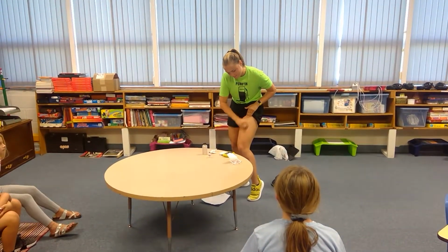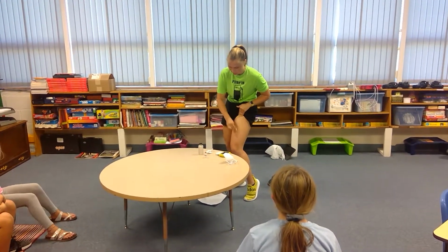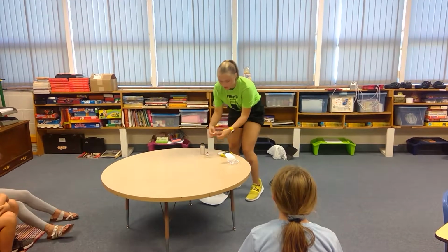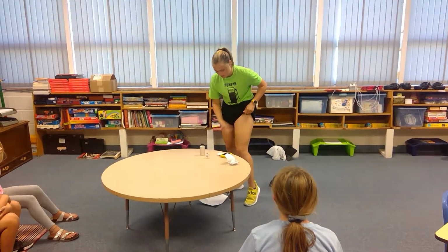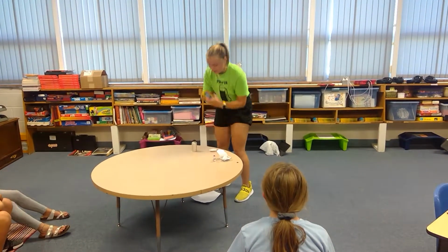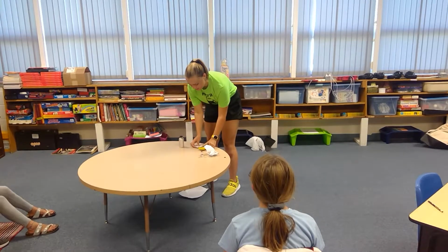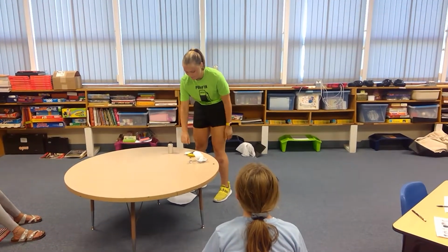And the priming takes just about a minute. Make sure it's nice and clean, and then we'll make sure it's nice and dry. So that's all trash. As you can see on here, it's loading. It's almost done priming. And we'll hit another beep in a second.